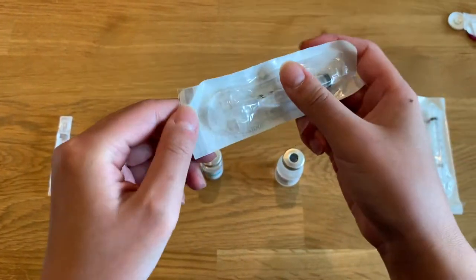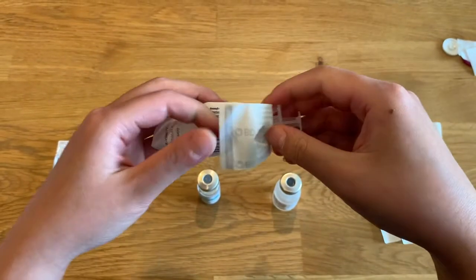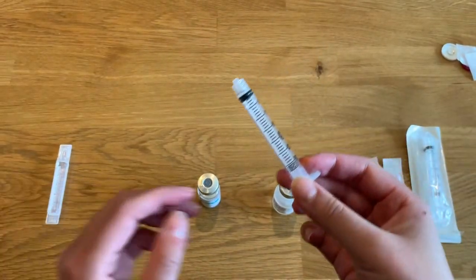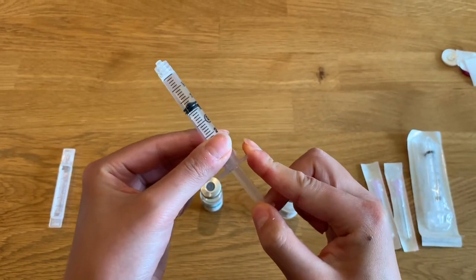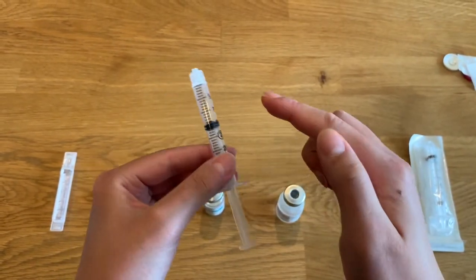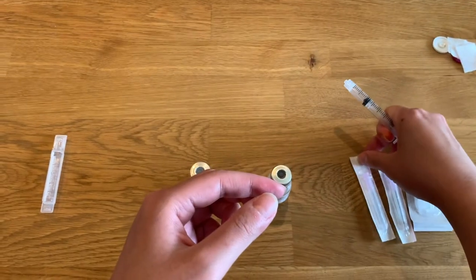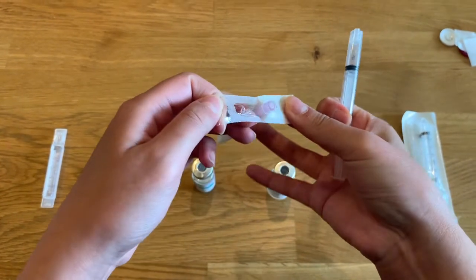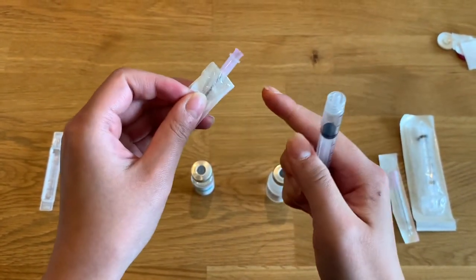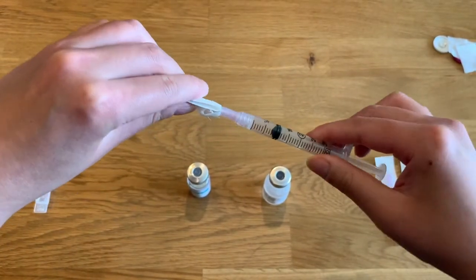Remove a 3 milliliter syringe from its package. Then manipulate the plunger up and down to ensure it is working appropriately, being careful not to touch the inside of the plunger or the top of the syringe as it is currently sterile. Then remove one of your hypodermic safety needles from its package, being careful not to touch the hub of the needle, and twist it onto the top of your syringe.